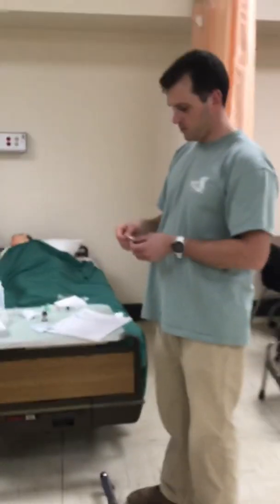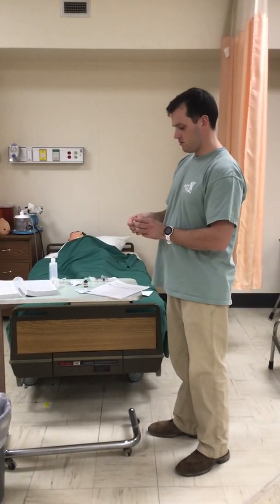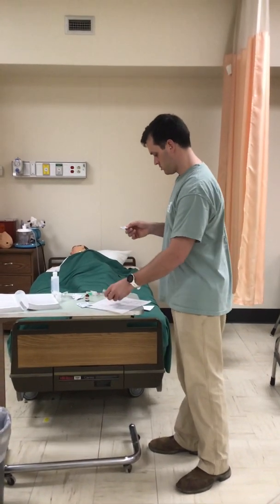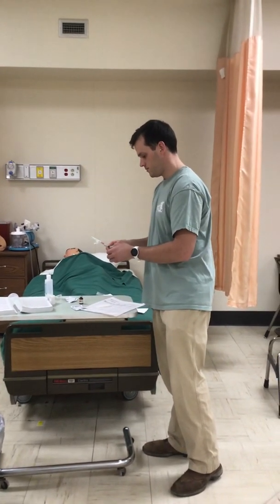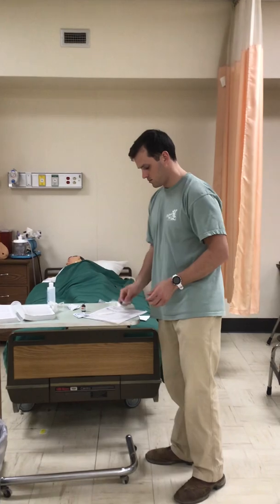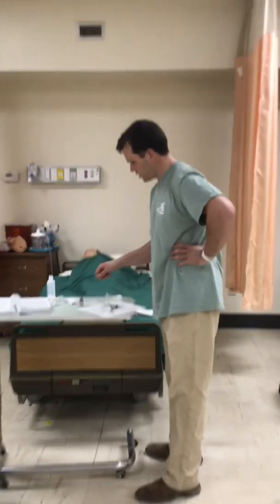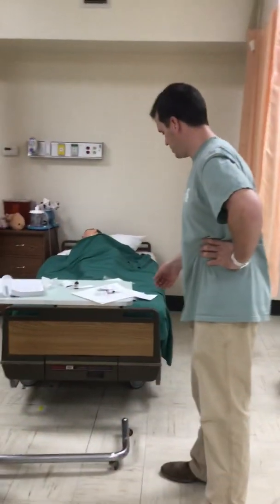I'm going to take my label, and of course my label will have patient name, Janet Green, the drug, furosemide, amount, 30 milligrams, the date prepared, and my name. Going to put that label on my syringe. Going to bring my antiseptic swab. And this time I'm ready to enter the patient's room.